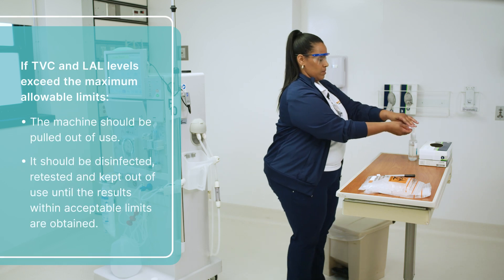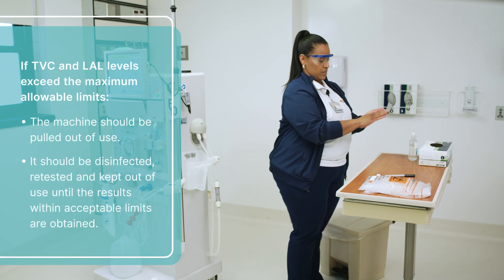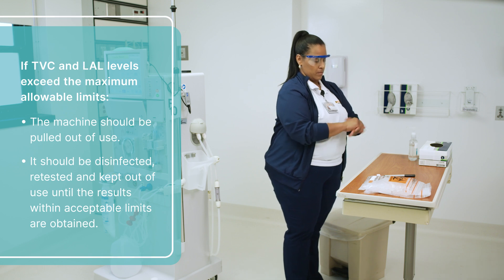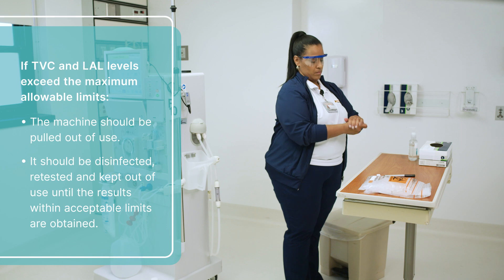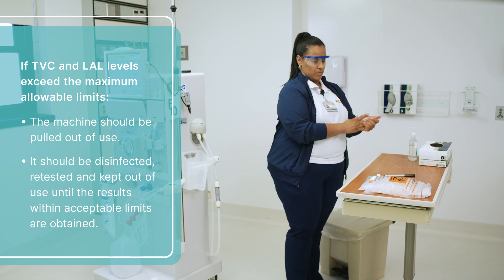If the test comes back with levels that exceed the maximum allowable TBC and LAL levels, the machine should immediately be pulled out of use. Collaborate with appropriate leadership and departments within your facility to determine the best course of action. The machine should be disinfected, retested, and kept out of use until sample results are back within the acceptable limits.